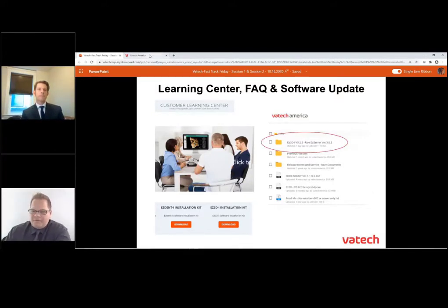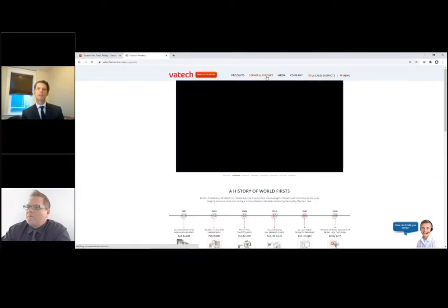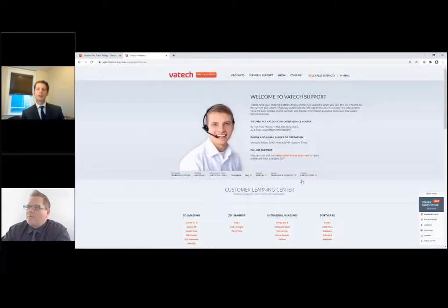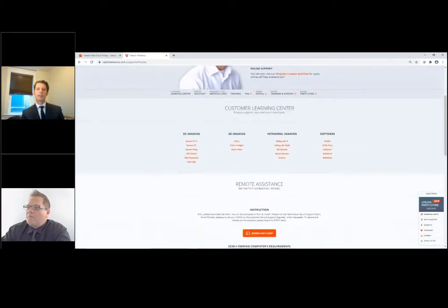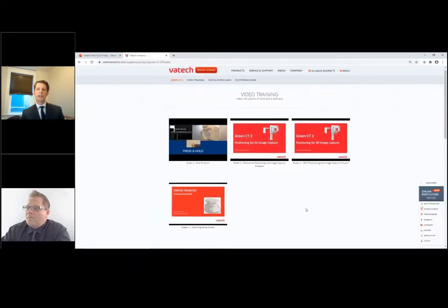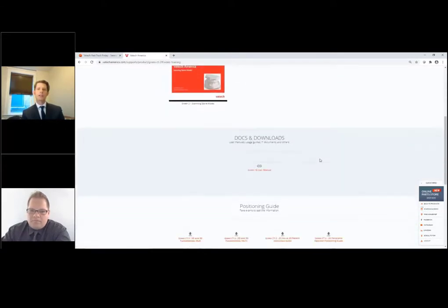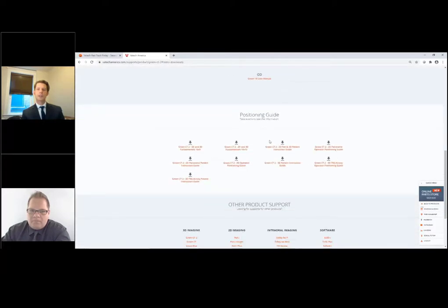Right. I just want everybody to be aware that if you go to Vatech and click on service and support, we have our customer learning center. Over here at 3D imaging and 2D imaging is where we have all of our user videos. It's going to ask you to create a new account, or if you already have one, you can log in. Do check out some of these videos. They go over evaluation of calibration of the device, pan positioning, CT positioning, your stone model, and then all the documents we talked about are down here.